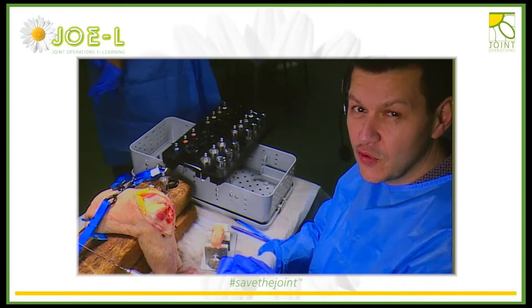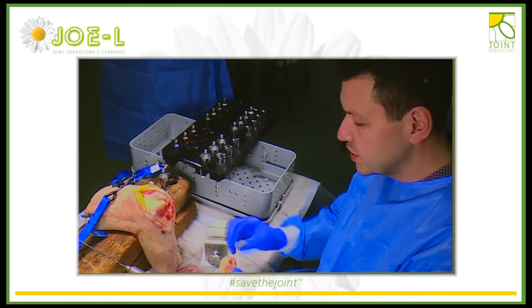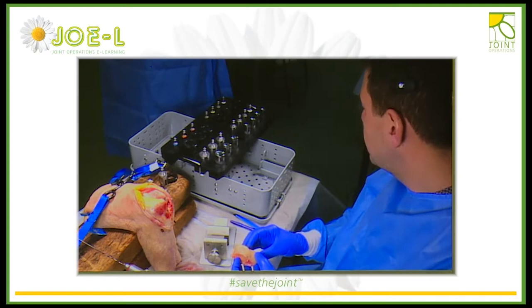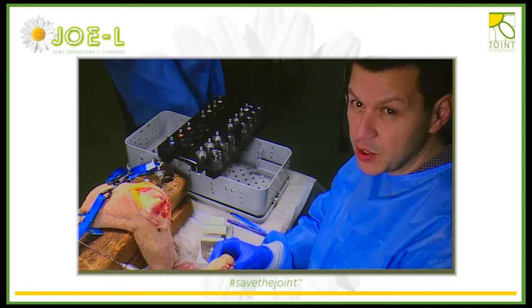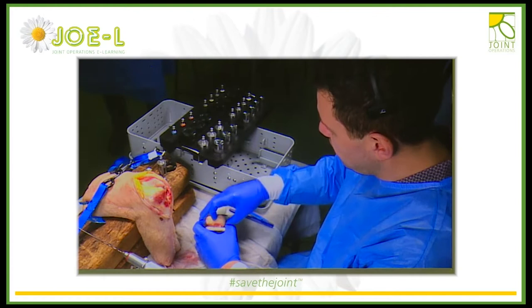We're going to do an osteochondral plug. There are two ways of doing an osteochondral allograft: one is the instrumented technique with a plug, and the other is a shell, which is more of a hand-shaped type graft. This is the easier method. This is the sort of set you need. This is a hemicondyle — this is what you would normally get. You will have sent the scans off and tried to obtain a match to the donor in terms of radius of curvature so you can get a nice fit.